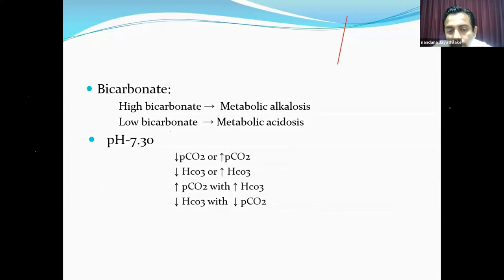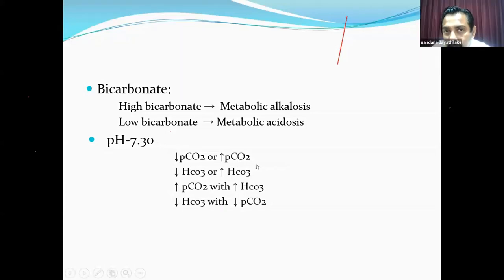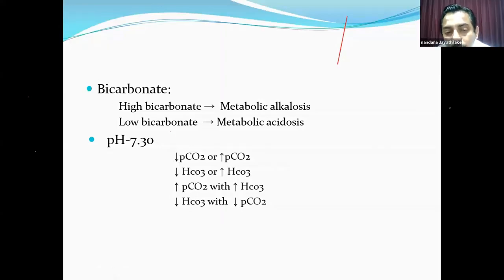Then you go to the bicarbonate. Can this pH be due to low bicarbonate? Yes. Can it be due to high bicarbonate? No. Then the third one, this will be tricky. So this pH is 7.30.